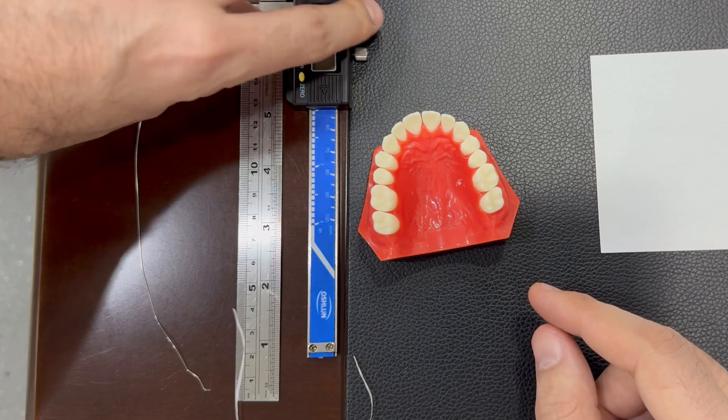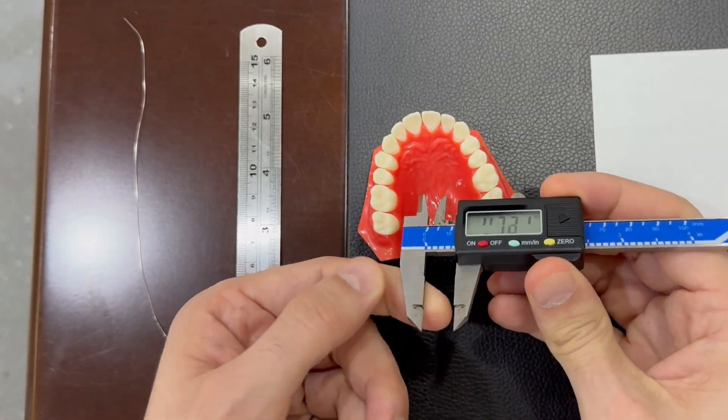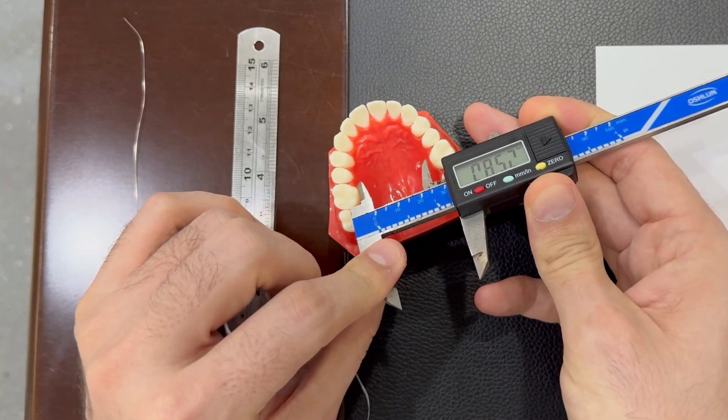We can also use this one if available — digital or manual — and we find that it is 33.